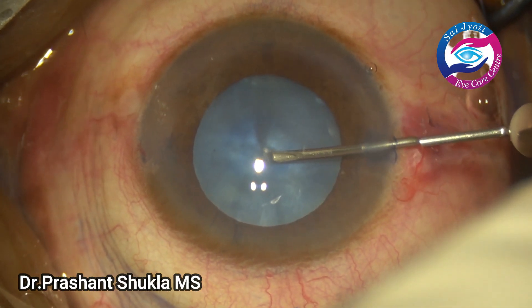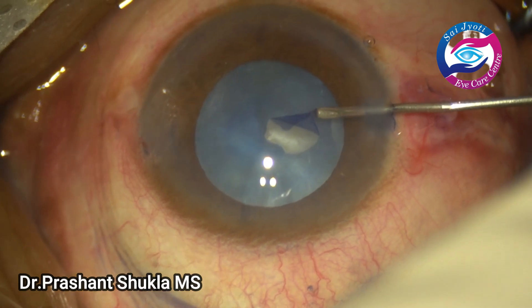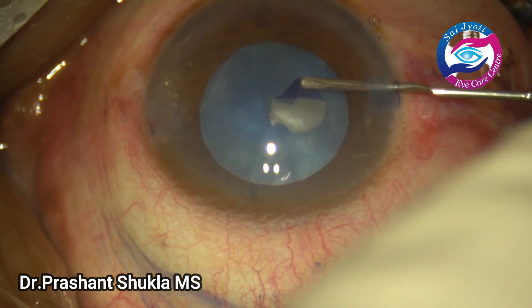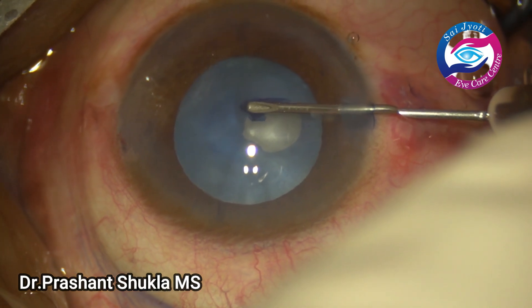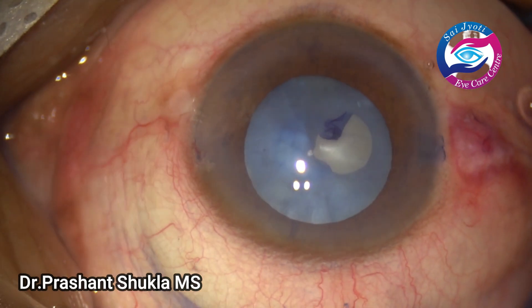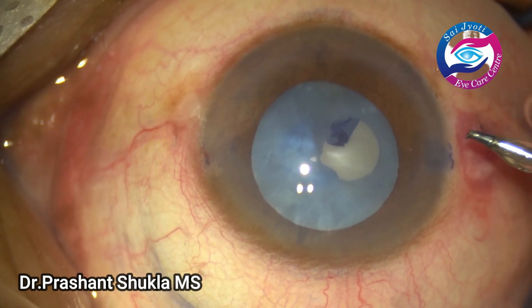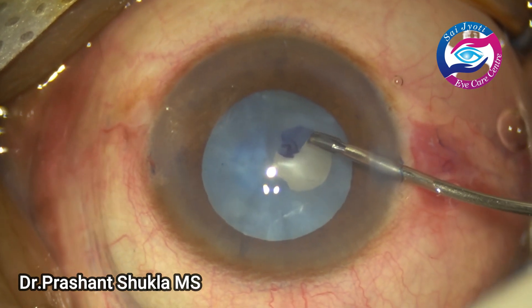Now taking a bent needle cystitome, I am raising a flap and aiming for a very small rhexis — a mini rhexis — because here I am planning to decompress the bag. I feel the lens is slightly intumescent and there is high intralenticular pressure.